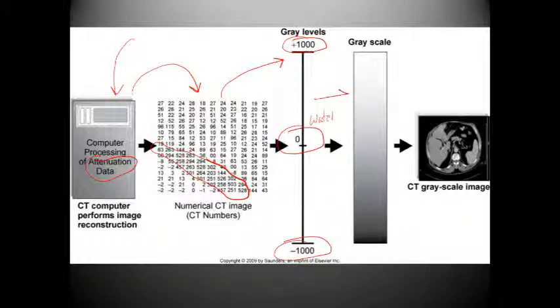So this brings us to a grayscale image. This grayscale image is then manipulated into something like this, which corresponds to the CT image. And so the finished product is something that is very useful and we actually have to have, but there are several steps to get there.